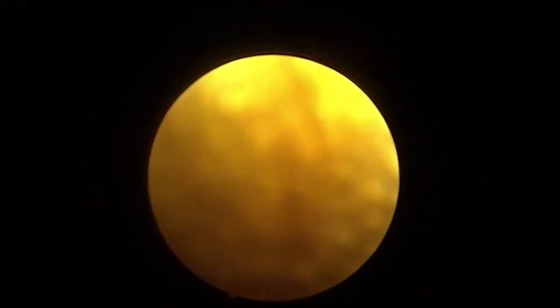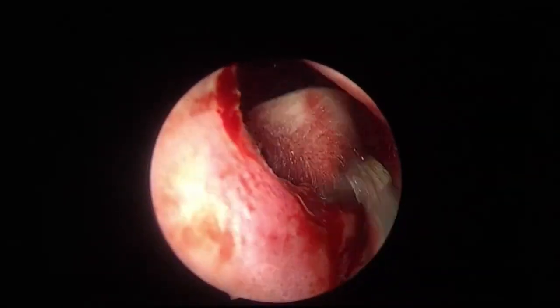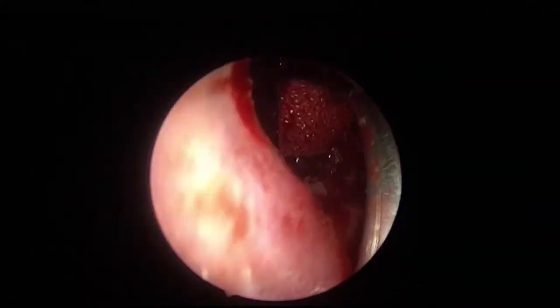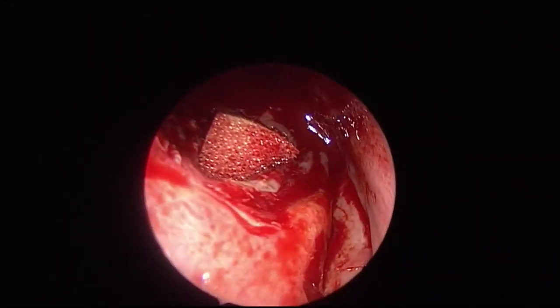Look, look. Give me a piece of Merocel. I'll mop out. Small one. Other hand. I'll mop out with the Merocel and complete the maxillary sinus anteriorly. There is a little bit of fungus in the anterior part of the floor.